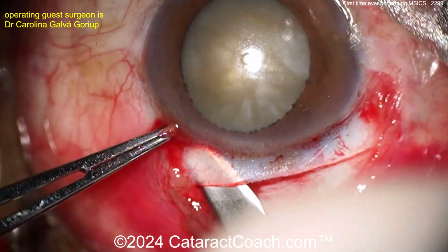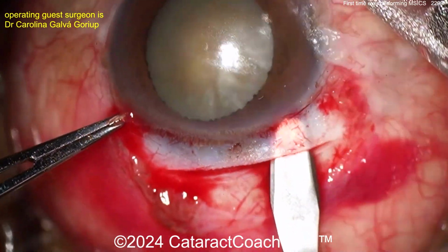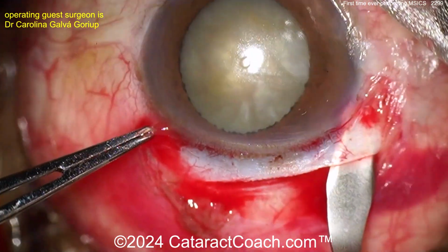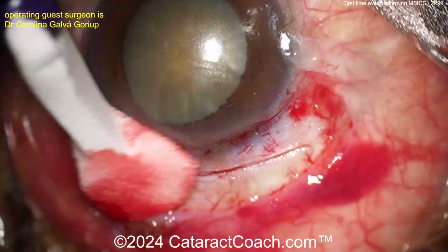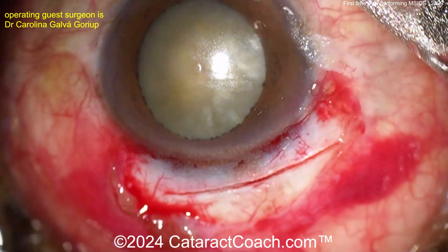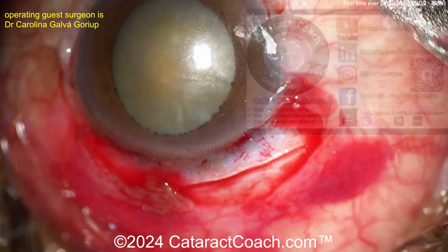And now go to the other direction. Yes, of course, we sped the video up. And now going in the other direction. And now you can see, there you go, nice wide incision. Still have not entered the AC yet. So that looks pretty good. Now here's a paracentesis. Probably going to put some trypan blue dye in. Here's another paracentesis. That looks good too.